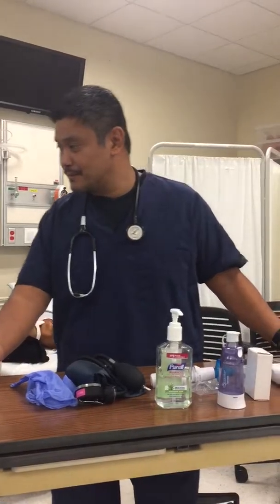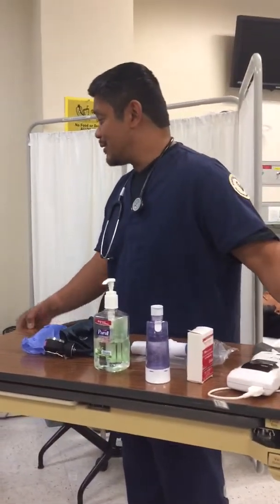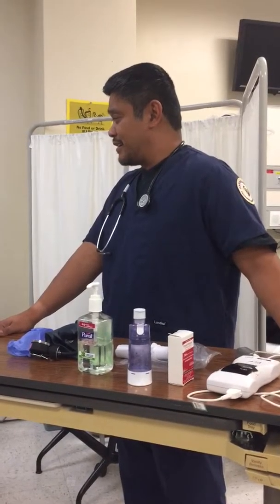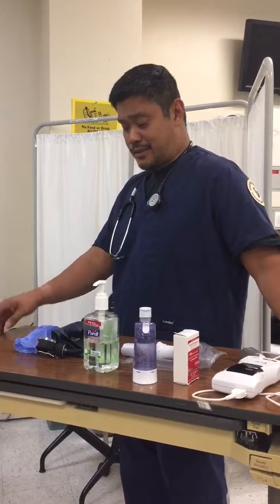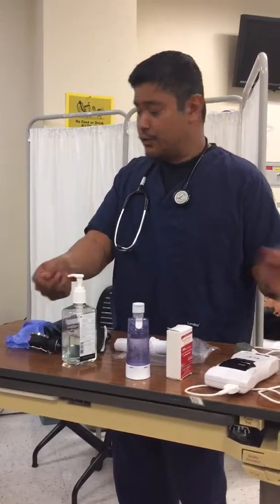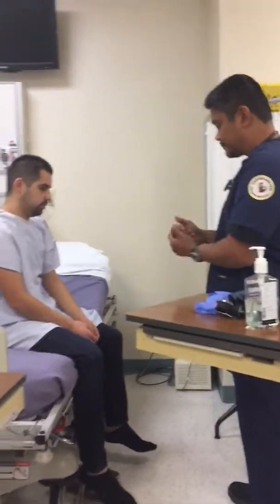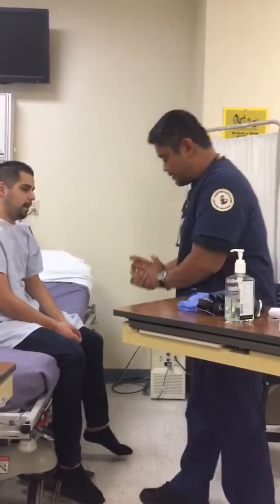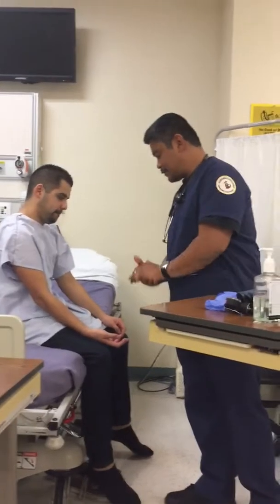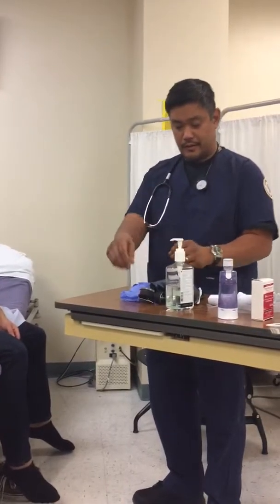Come in. Hi, my name is Richard, and I'm a student at Hartnell College. I'm here to do a MDI, a metered dose inhaler instruction, with you. Okay. And may I have your name and date of birth? Christian Galvin, May 25th, 1991. All right, may I take a look at your wristbands? Oh, thank you. May I call you Christian? Yeah. All right, thank you, Christian.